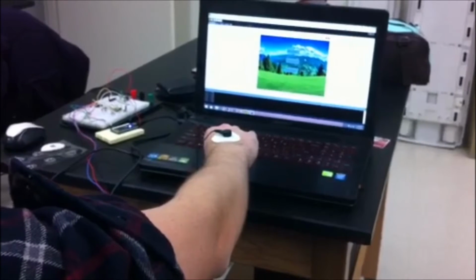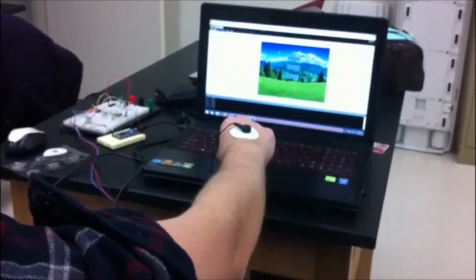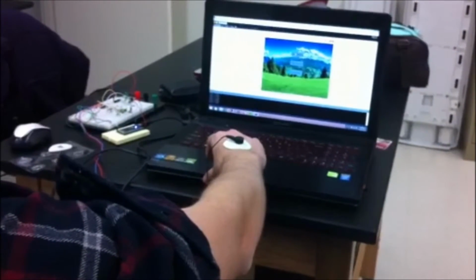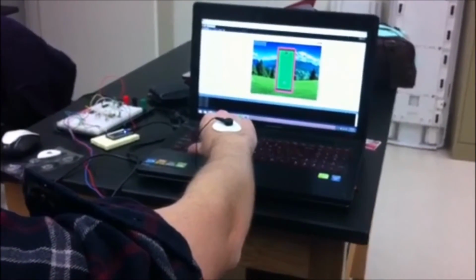Hey guys, this is the beginning of our demo here, so I will go over the game a little bit more in detail when we have a closer up view of it, but I wanted to show you it live in action. So I'm going to start a new game. So here you can see our little golf course. This is the only level we made.